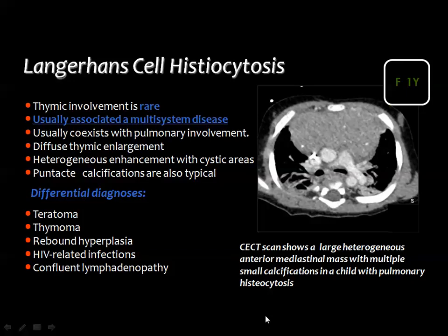And histiocytosis of the thymus is rare, and this lesion is usually associated with other manifestations of histiocytosis elsewhere in the body, especially in the lung.